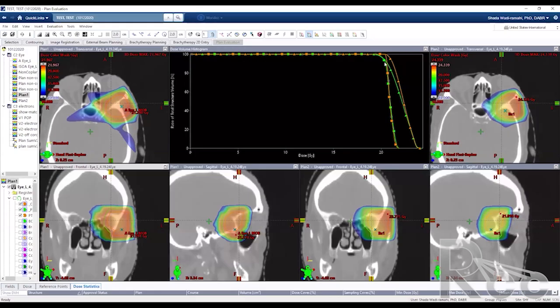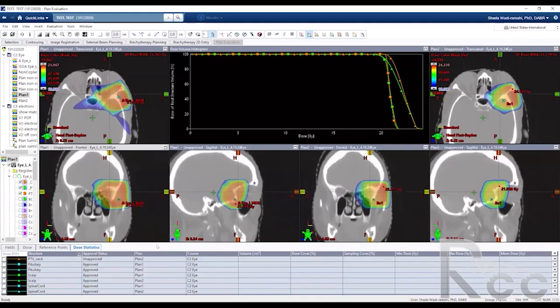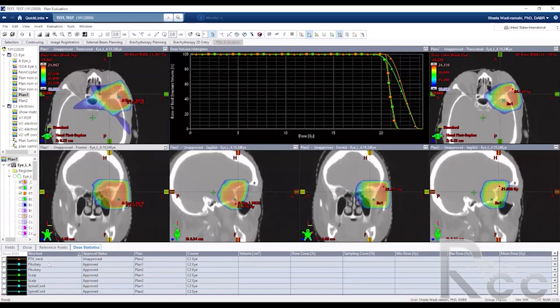If you're only looking at one point, 95% to 95%, or maybe 95% dose to 100% coverage, that will not tell you that you are probably missing an entire strip of PTV that you're not covering. Now, let me turn on other organs at risk just for a quick comparison. I know we're running out of time already.